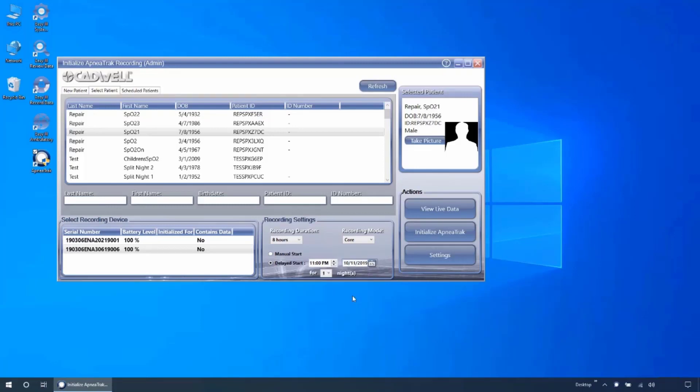Once you have finished configuring the device, click initialize ApneaTrak. If you have not configured your protocols in the ApneaTrak setting menu, then you may see the settings menu pop up asking you to select these items.